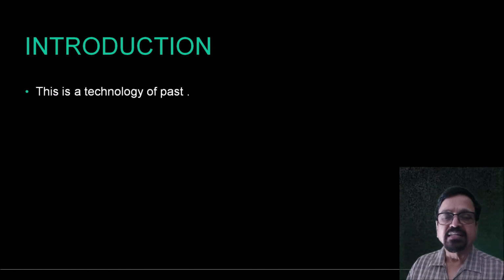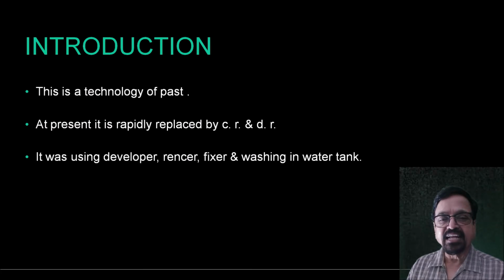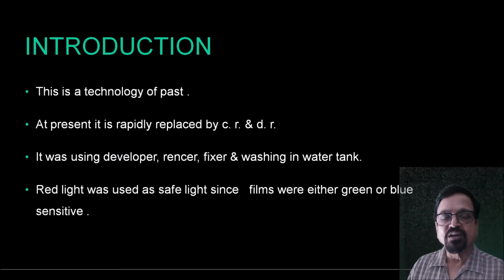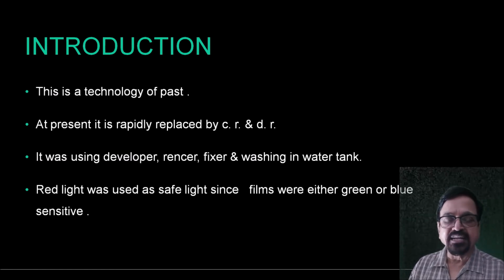Now, this is a technology of the past, as I told you. Today, it exists in very few centers, and at present, it is rapidly being replaced by CR and DR. The technique used developer, rinser, fixer and washing tanks. So it was really a bulky place and a messy place where a lot of water was seeping and a lot of chemicals were being used which needed to be handled properly. Also, all these things needed to be done in a dark room.